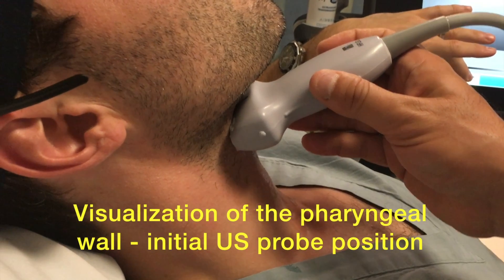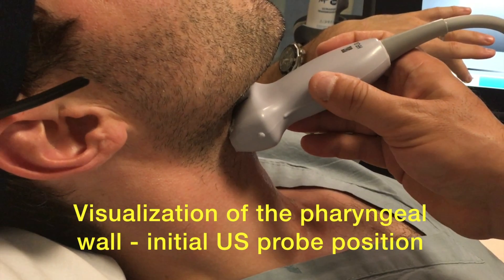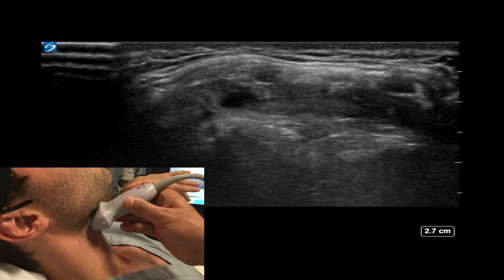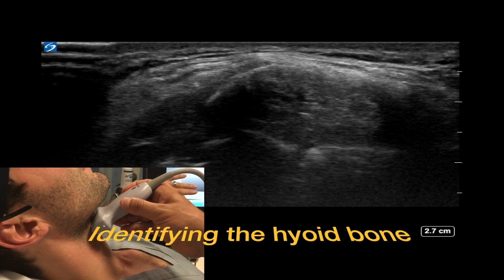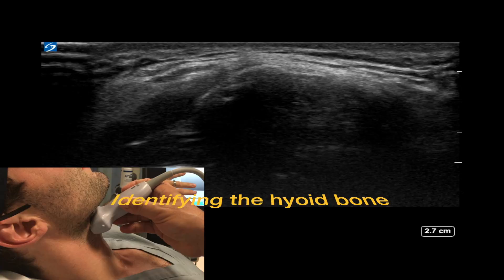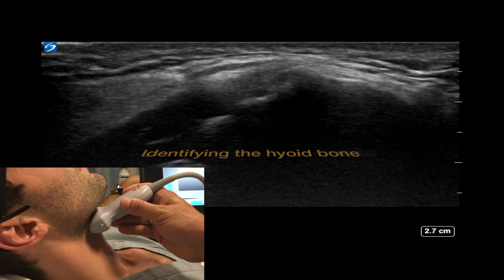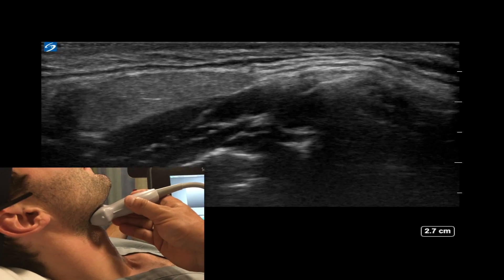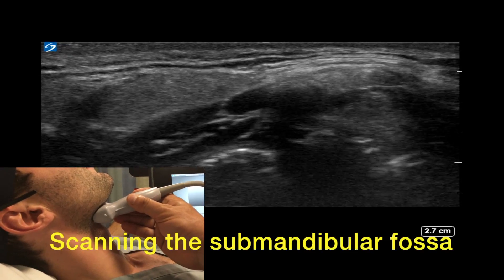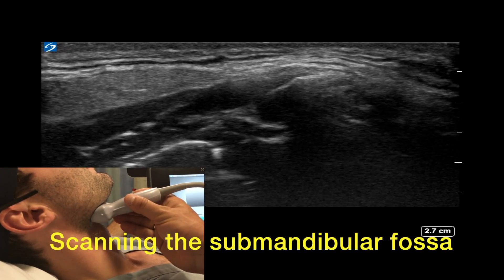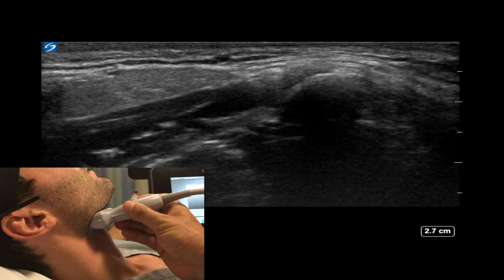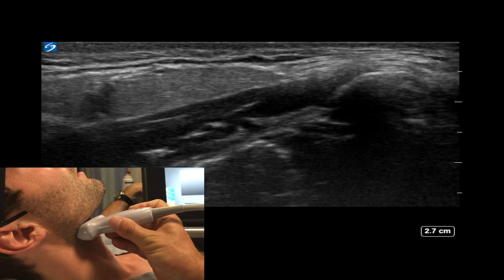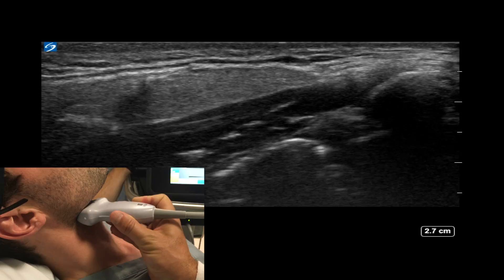This suggested technique for ultrasound-guided distal glossopharyngeal nerve block requires visualization of the pharyngeal wall. That starts by visualizing the hyoid bone, then rotating the ultrasound probe laterally and cephalad to visualize the structures in the submandibular fossa, including the submandibular salivary gland, the two muscle layers with the facial vessels in between, and the pharyngeal wall.